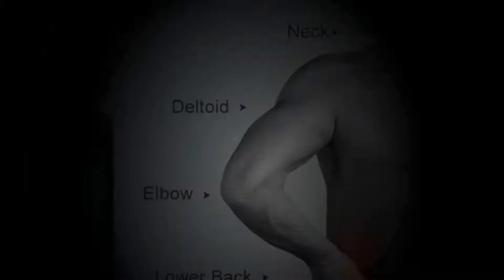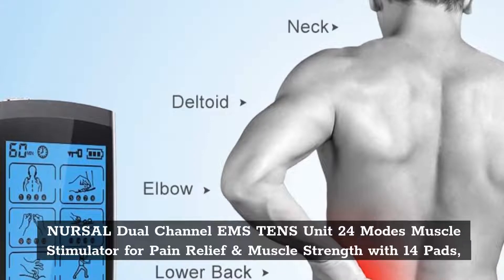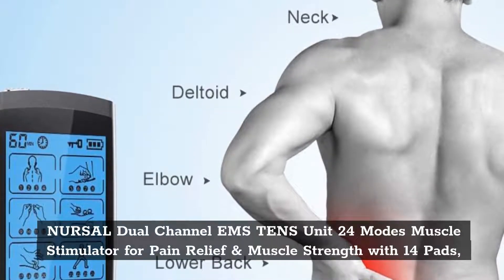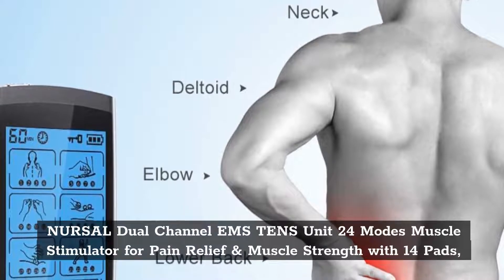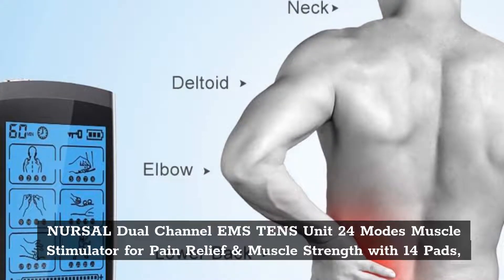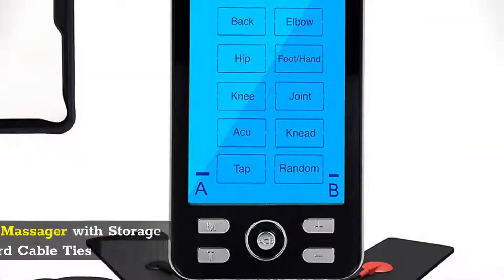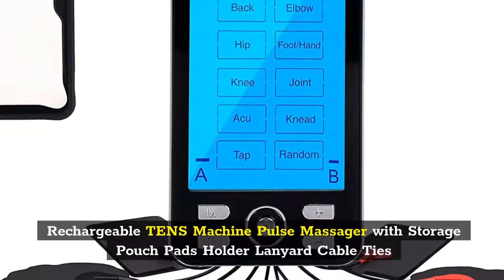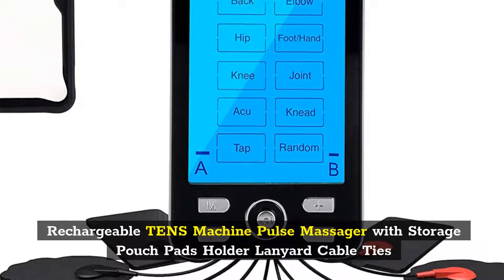Number 3: NERSOL Dual Channel EMS TENS Unit, 24 Modes, Muscle Stimulator for Pain Relief and Muscle Strength with 14 Pads. Rechargeable TENS Machine Pulse Massager with Storage Pouch, Pads Holder, Lanyard, and Cable Ties.